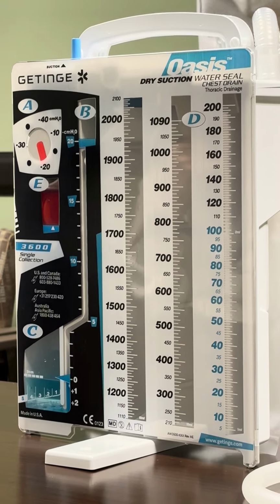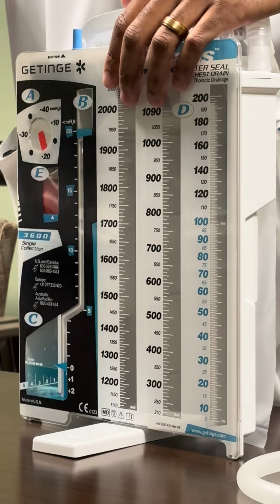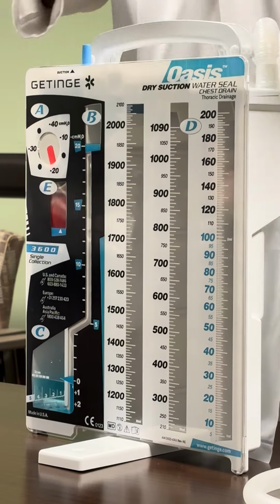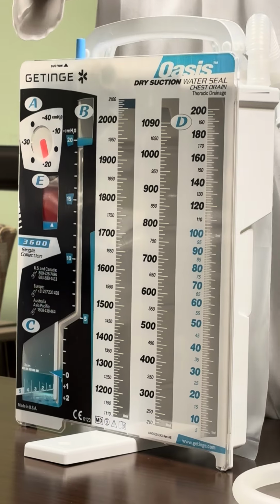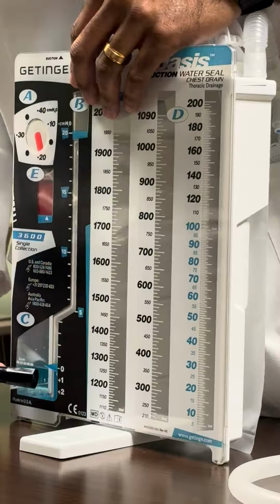If there is a pneumothorax going on, we're evacuating that. So some air bubbles initially are okay, but when you have a time where you have lack of air bubbles and then you see them again, we might have a problem, right? We'll talk about that in a little bit.